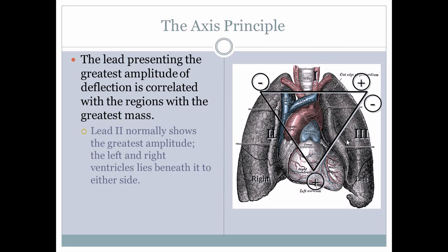Axis in this case is not necessarily referring to a point around which something moves, like the axis of the Earth. It's not a rotational thing.